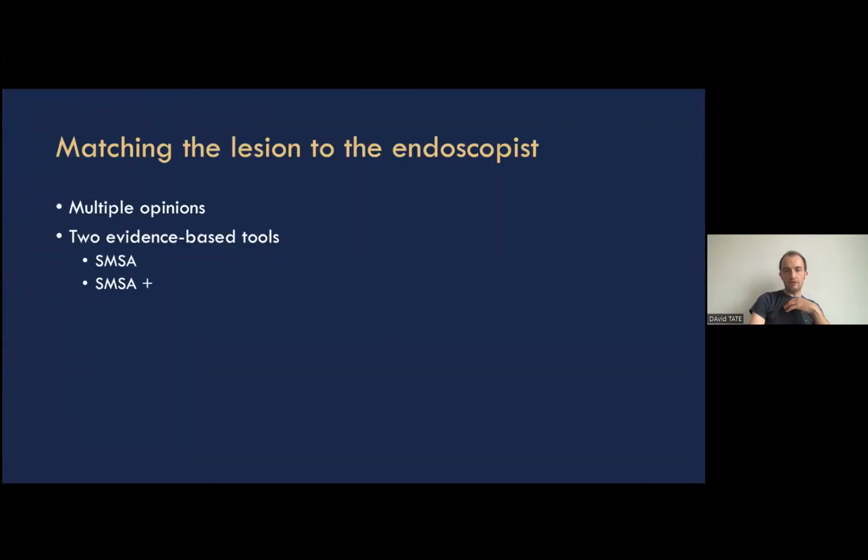So that's a little bit about imaging. We will talk to you about what granularity means and the different examples of how to apply that. But I want to say one other thing, because it's not just about imaging of polyps in terms of cancer risk. It's also about, should I be doing this polyp or should somebody else be doing it? Should I just make an attempt at this polyp or should somebody else be doing it? Or should nobody be doing it and should it be for surgery? And the for surgery question, I think, is certainly based upon endoscopic imaging.